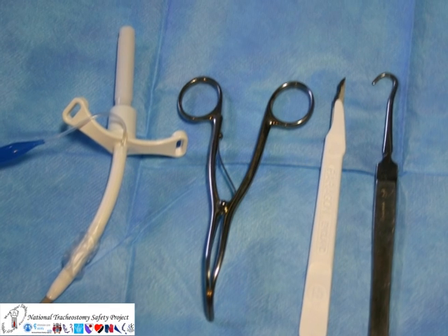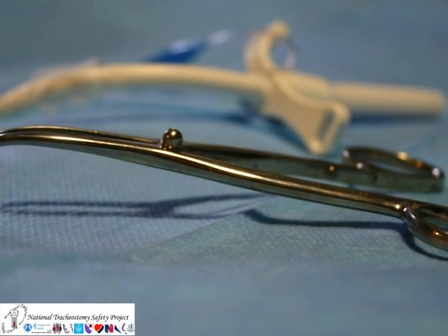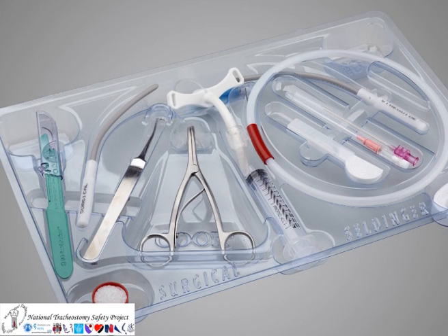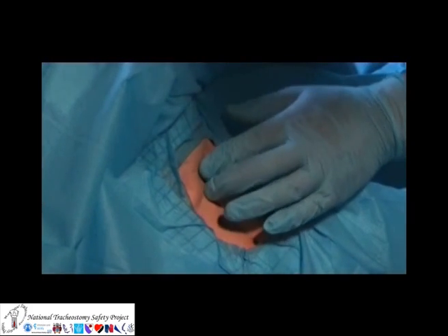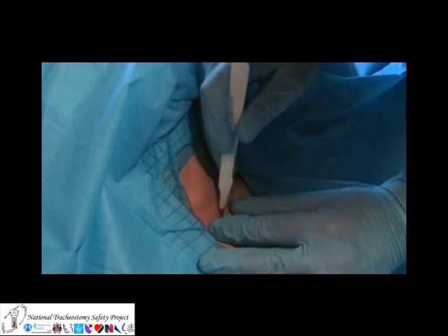Surgical cricothyroidotomy can be achieved just using a simple scalpel, but tracheal hooks or tracheal dilators can be useful. Combined surgical and percutaneous kits are available. Identify the cricothyroid membrane and then fix the structures of the neck with your non-dominant hand.